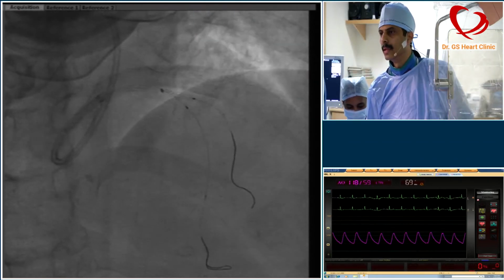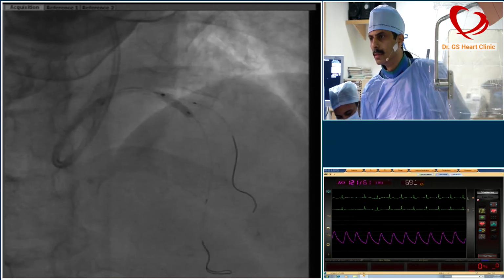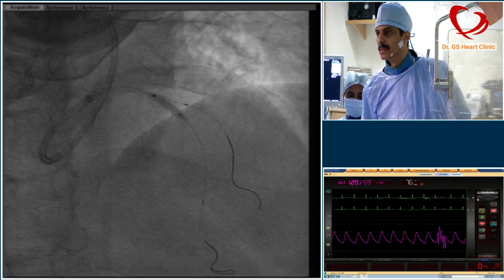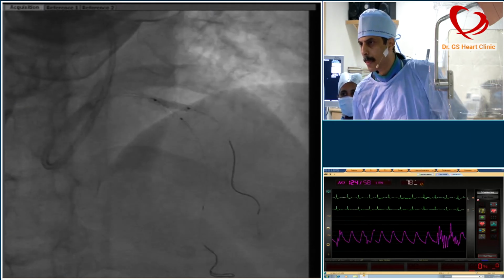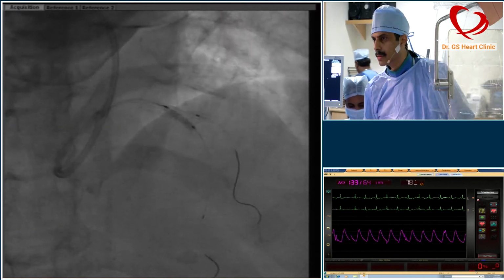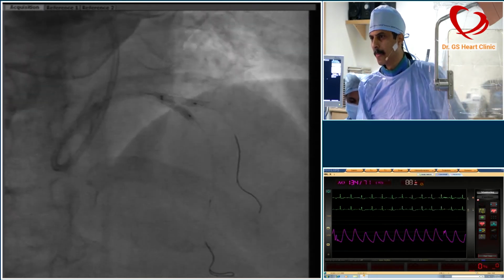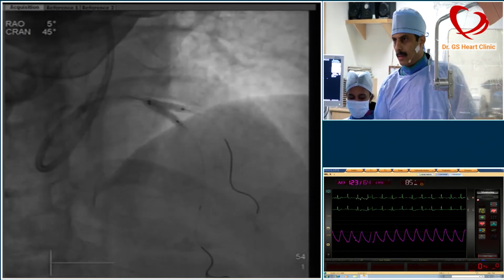Yeah, go up 20. 16, 18, 26. Okay, good. Negative. This you go 12. 12. 16. 18. Negative. 12, 12. Okay, LED 16. 14, 16. Keep it like that. Enough. Negative. Okay.